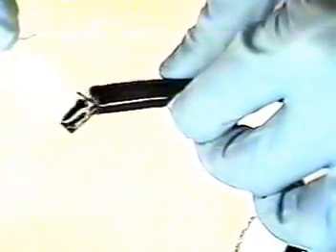We will now glue our top binding. Carefully hold the scope, being conscious of our first glue job.